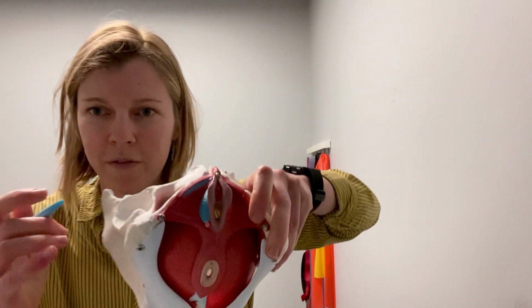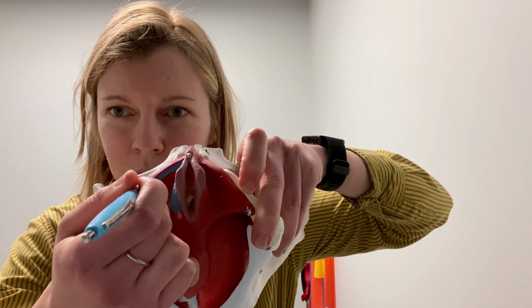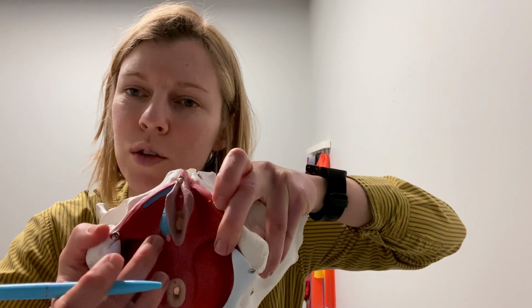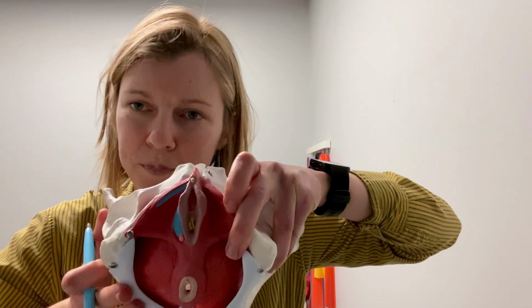So here's where we often target. This ischiocavernosus muscle. We'll go directly into that muscle with the needle. Imagine this pen is the needle. Oftentimes this bulbospongiosus muscle, we'll needle right along that, often with one finger vaginally. We can target this superficial transverse perineal muscle. Again, the needle going right in, often with a finger backdrop.